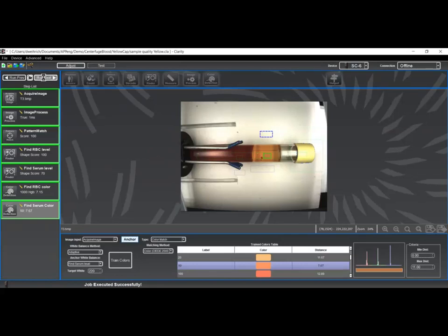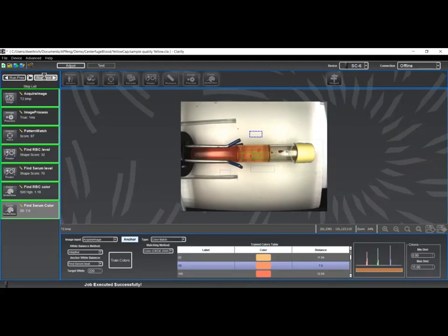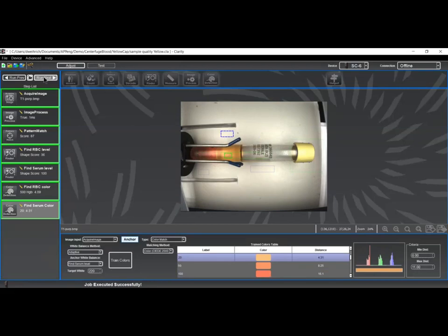For these representative samples I have, you can see that my color matching does indeed span over several of these reference colors that have been stored already. And some are drastically different based on their color distance, and some are reasonably close based on their color distance. Again, we're matching the color here to the reference color. This color here is a result of the white balance operation played against the color patch area.